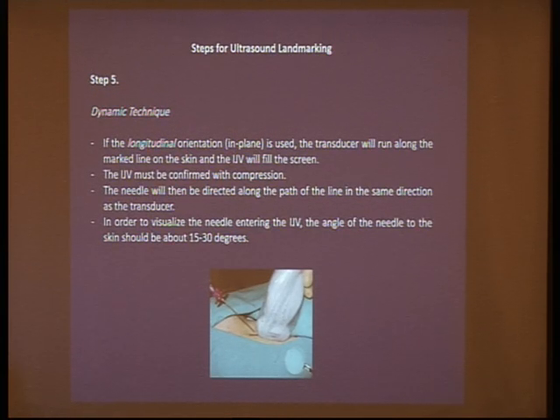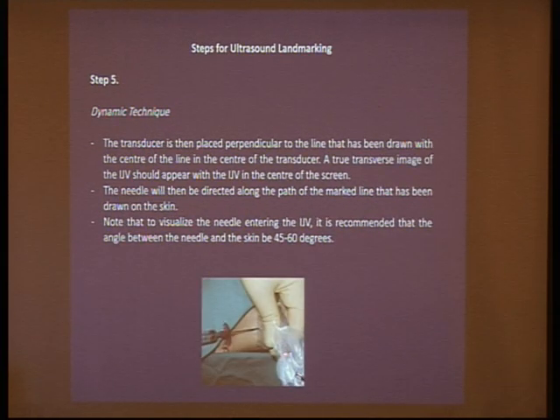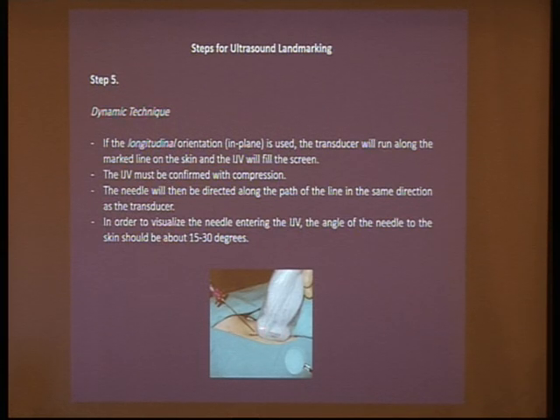There is also one trick: in transverse view the angle is usually more like 60 or 45 degrees, while in longitudinal view cannulation, the needle is more tangential to the skin. Again, this is variable from patient to another.